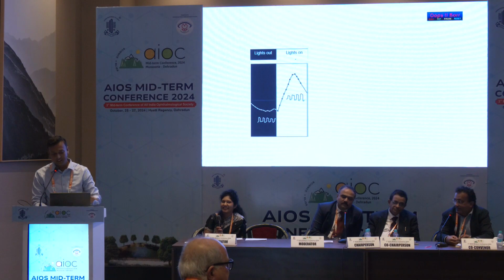So this is how. ERG will be useful only if we know about the disease, about the symptoms, and then finally we correlate all these things.